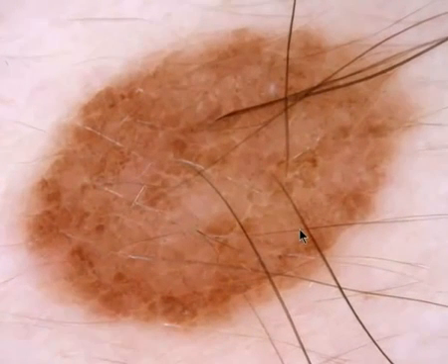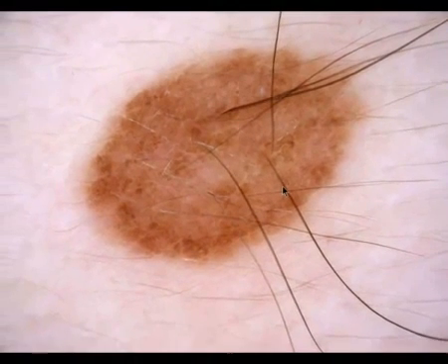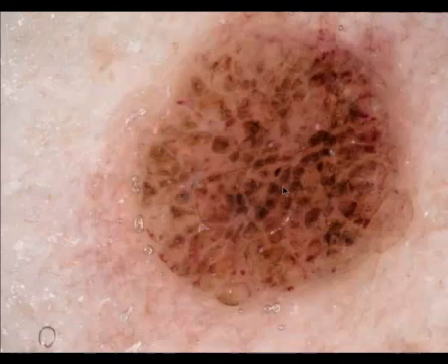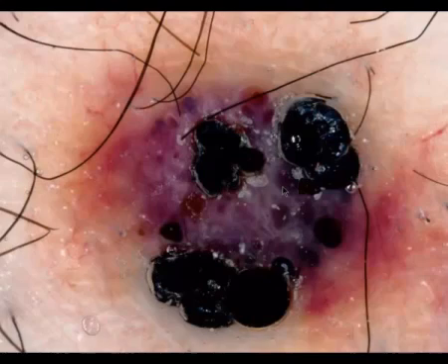You can diagnose the congenital nevus with certainty because of the increase of terminal hairs. Brown clods, they are so big. The clods are so big that we may call them, if you like, cobblestones. It's also a congenital type nevus. Black clods. Usually it's a thrombosed angioma, like in this case. You also see some purple clods here.